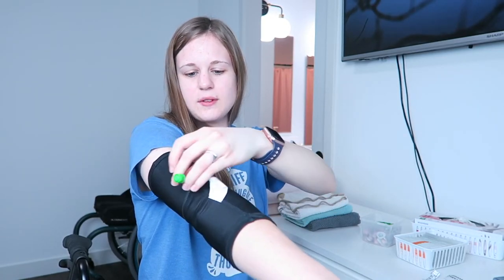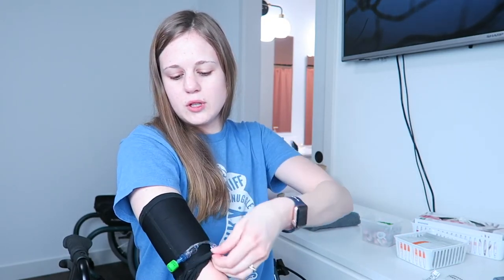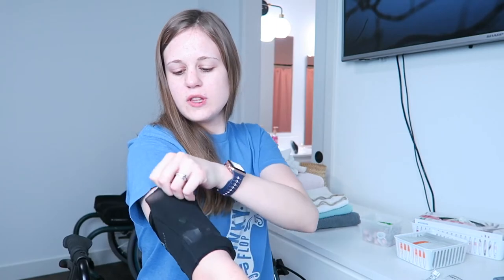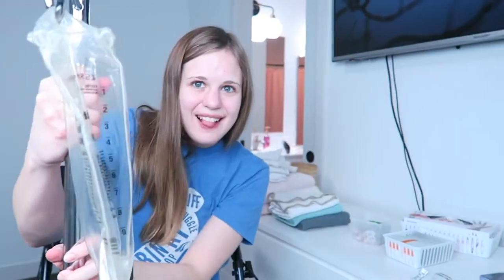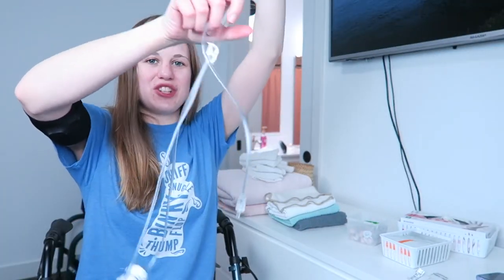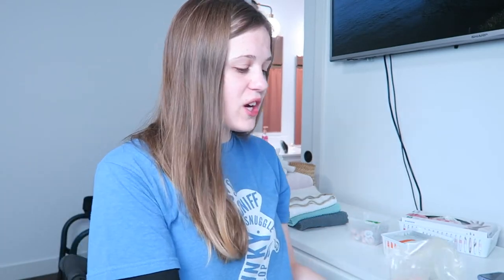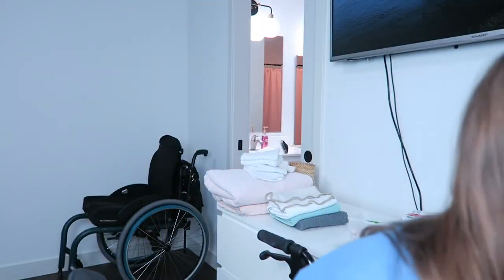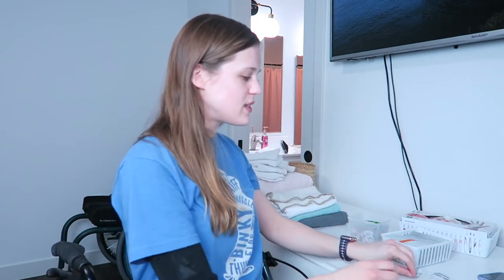Come on. I always wrap it around like twice because I feel like it stays better. And then you pull the Mighty Well cover over the top. Like that. And then for this, honestly, all you have to do, can't even see it. There we go. This goes right in the trash, so it's not that big of a deal. And then everything else on the counter goes in the trash or back in the drawer. So yeah, that's basically it on how I do my infusions.